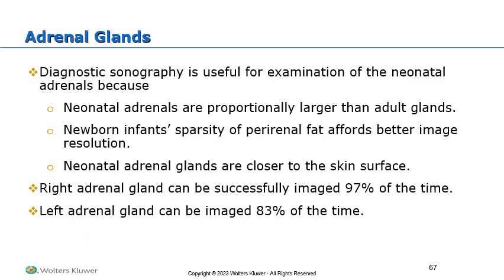Okay, on to adrenal glands. Diagnostic sonography is useful for neonatal adrenal glands more so than in adults. Well, we almost never use it for adults. We do for our neonates, because the adrenal glands are more prominent in our neonatal population. In addition, neonates have very little body fat and very little distance between the scanning window and the adrenals themselves.